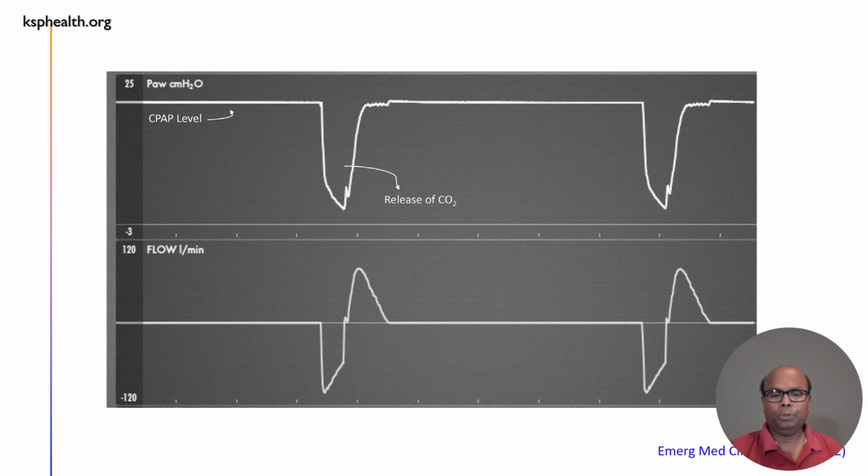As I explained to you, it is continuous CPAP with a release pattern. During the release time, the carbon dioxide is eliminated. As I said, the patient can spontaneously breathe in between the releases we set.